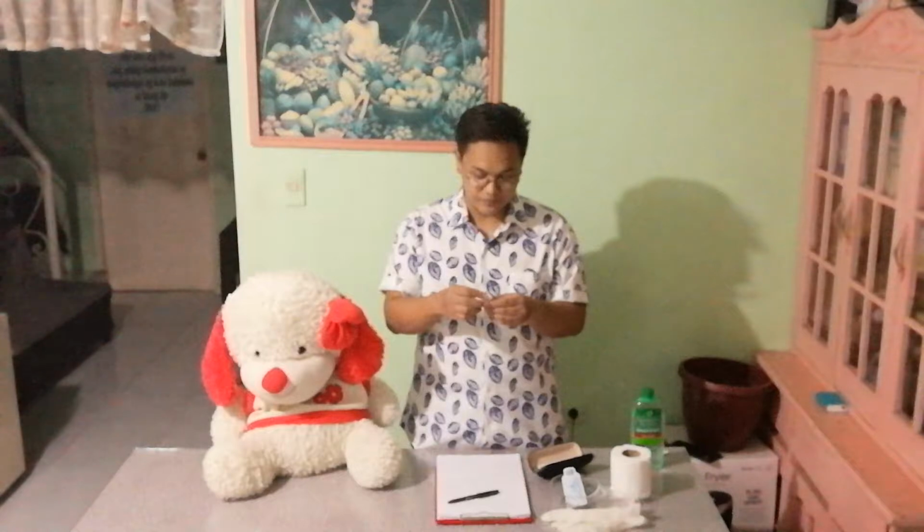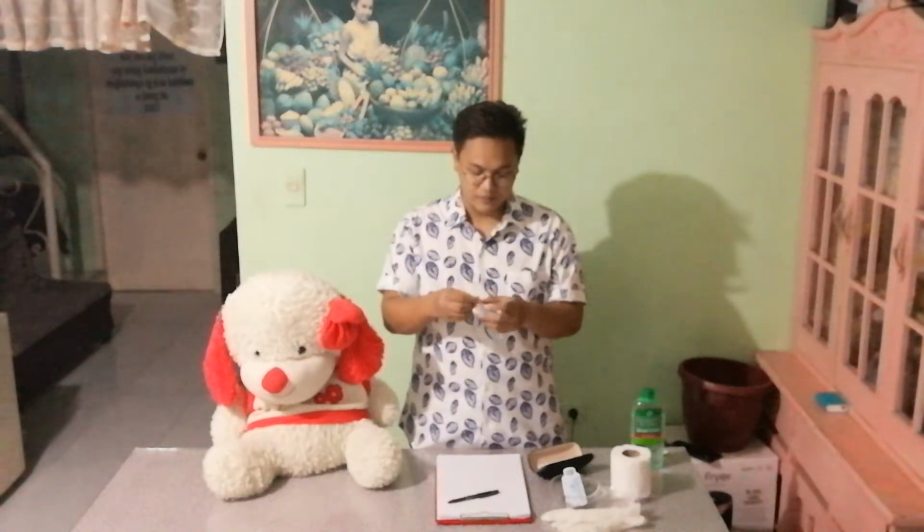So we need to cover the probe with a disposable probe covering, and we need to slide it on and let it snap in place.